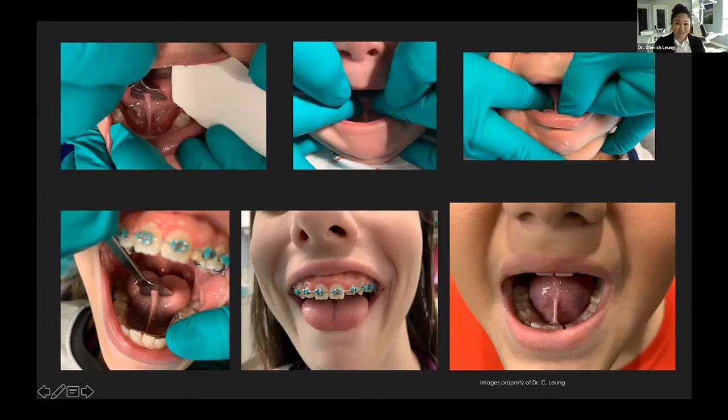This one, if anyone saw, you can totally tell that's a tongue tie. How he survived this long with that, I'm not really sure. But super anterior tie, really thick, and pulling so much on this gingiva here that he had a little bit of recession behind those teeth already.